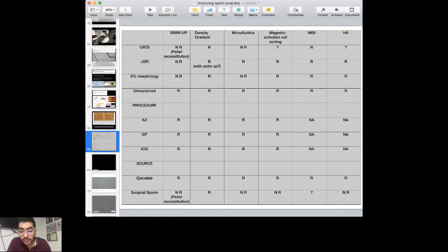So before I come to this flowchart, let's just answer one more question. Would you use processed sample and perform fluidics or directly from raw sample? The protocol says that you mix it with a little bit of media and then use it. It does not specify processing the sample. So generally, it's just raw sample mixed with a little bit of media for the smaller device, and for the larger device, it's only the raw sample. So that's what you do for microfluidics, right?